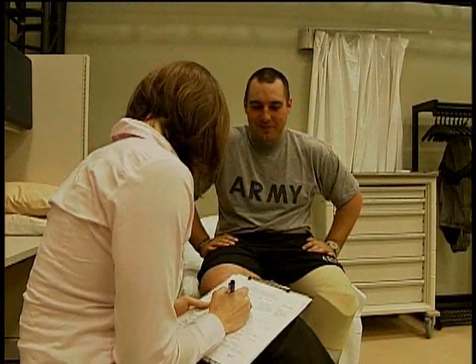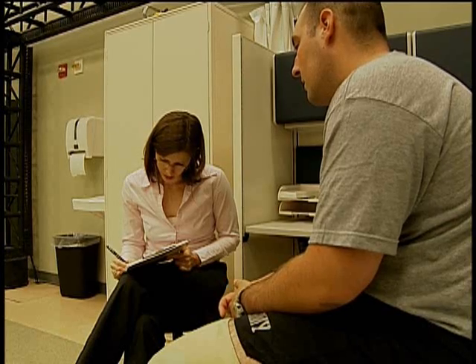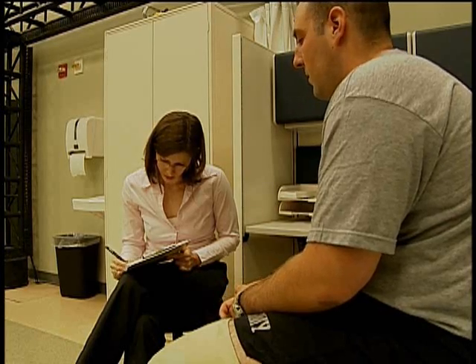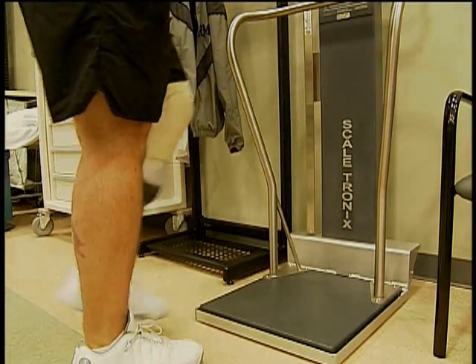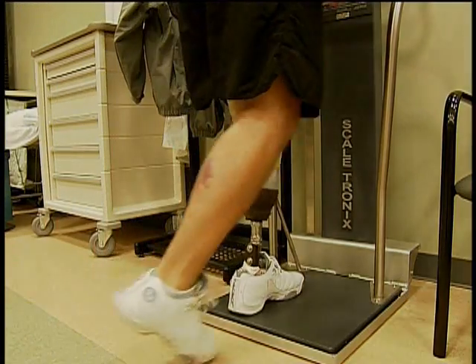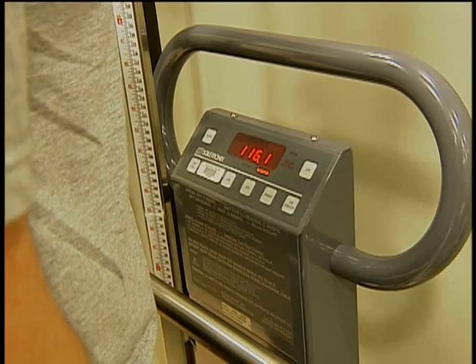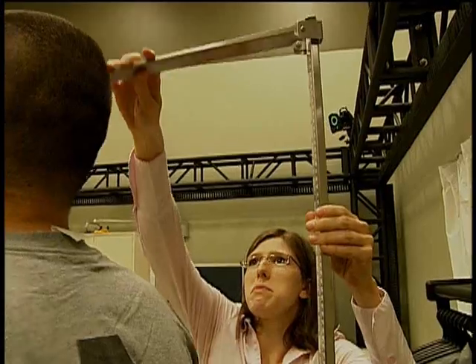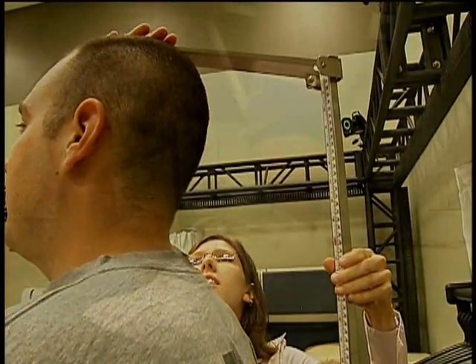The evaluation process begins with an appropriate clinical or research referral. Typically, a clinical history is obtained from the patient and other team members. A physical exam is performed to include assessment of range of motion, strength, muscle tone, motor control, sensation, and balance.